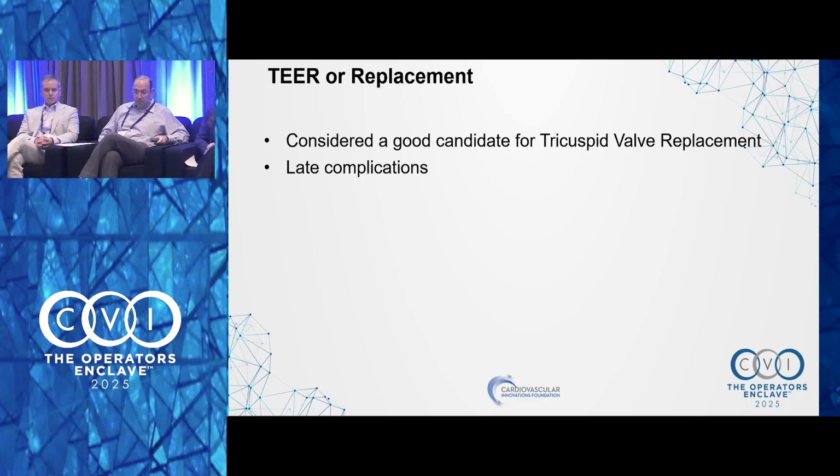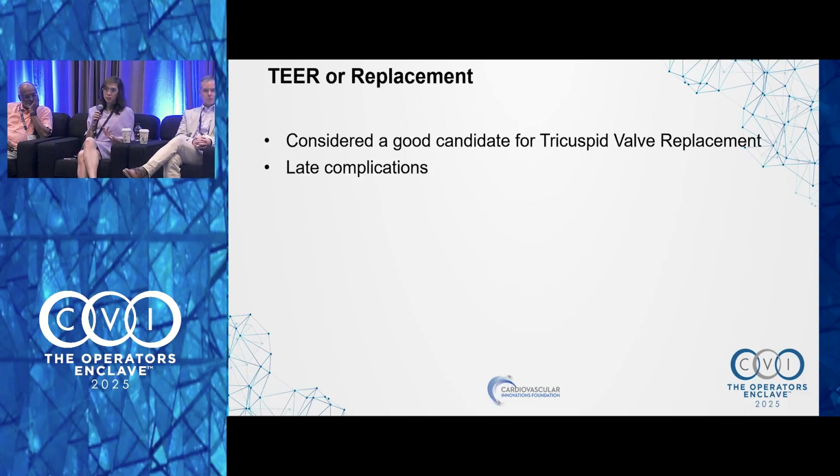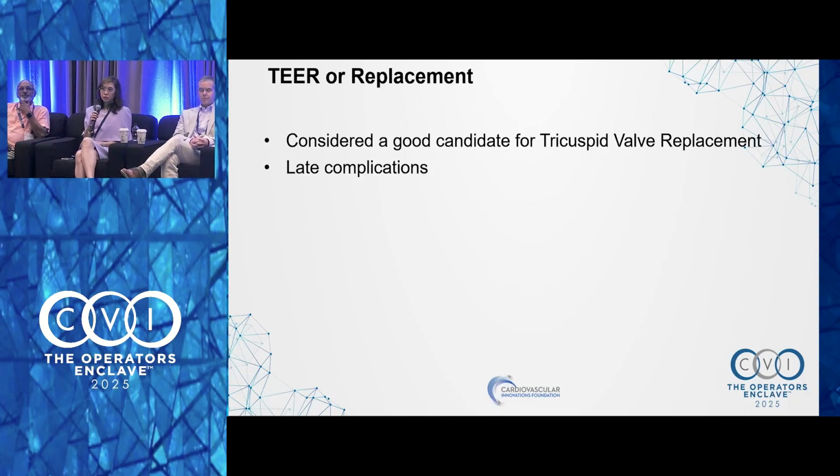So, first option is lead extraction, obviously with good medical optimization as well, to see what's the next best option. And I think the most important thing which you did as well, before the lead extraction, was getting a CT to first see the viability of a TTVR in case anything happens, because you do need the workup before a lead extraction.